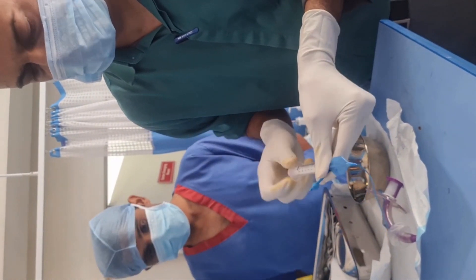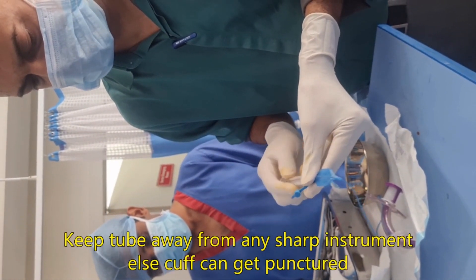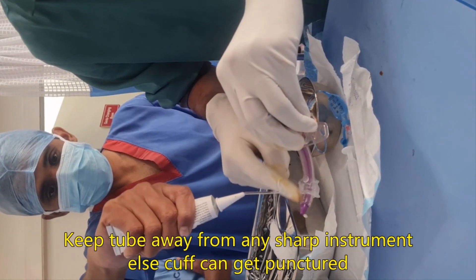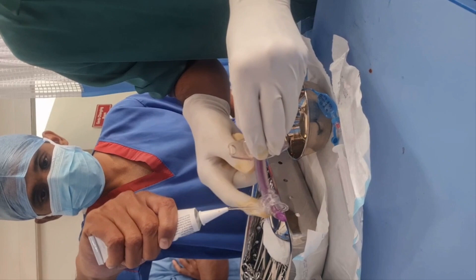We completely deflate the cuff so that during insertion it will not cause any obstruction. Apply jelly on the cuff and the tip of the tube so that insertion becomes easier.